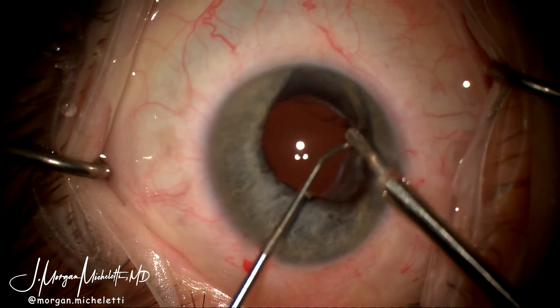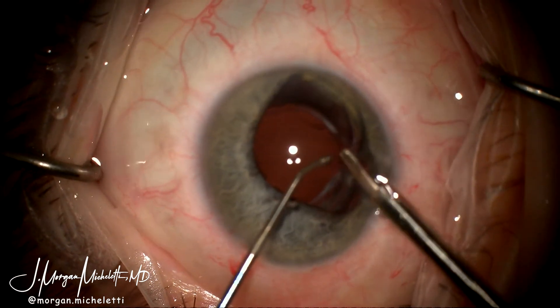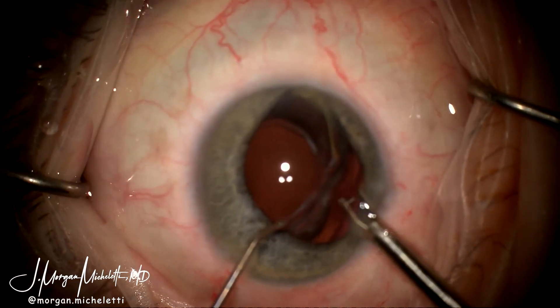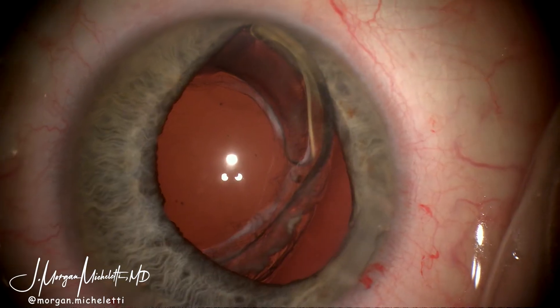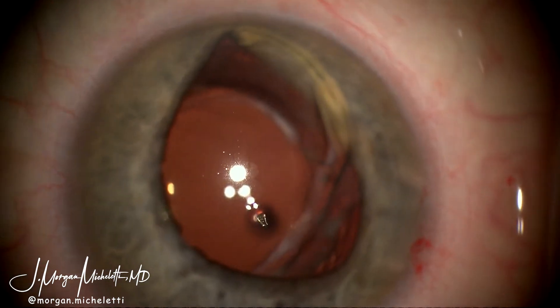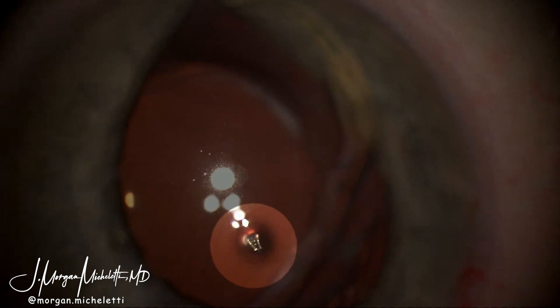This is the first intraocular creation of a hole within the IOL, allowing the lens to be salvaged. A second instrument was used to help free the punch from the IOL. After this, an anterior vitrectomy was performed and you can see there's a nice hole created in the lens. I zoom in here on the core sample that is removed from the acrylic lens itself.